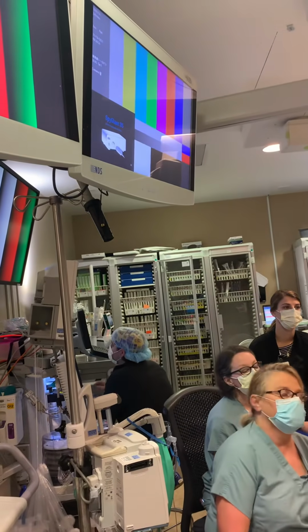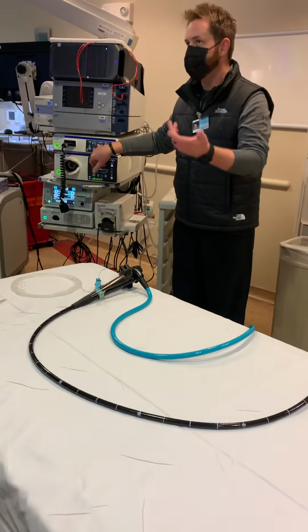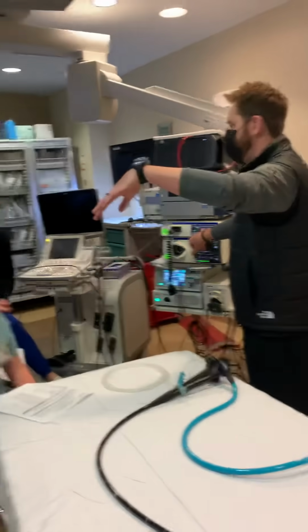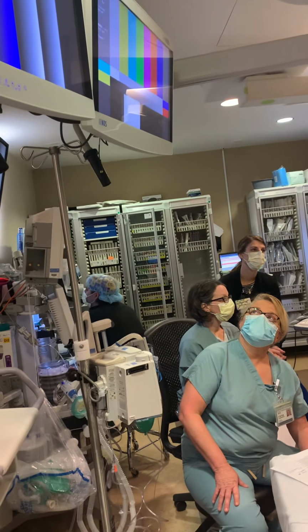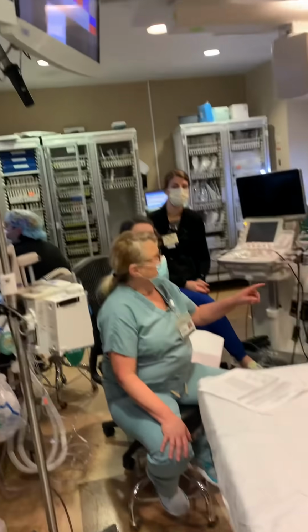monitor as well. And then after that, we just go back to custom 1, and custom 1 is now just, do I want my picture-in-picture image large or small? I can just change the setup until it cycles back through to picture-in-picture is off. Does that make sense? Well, do you do that right away, or?